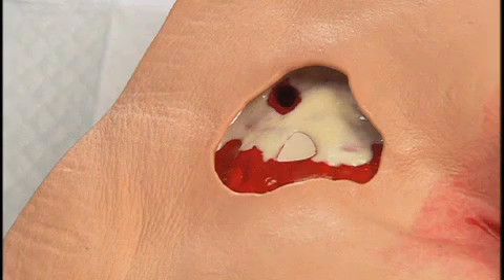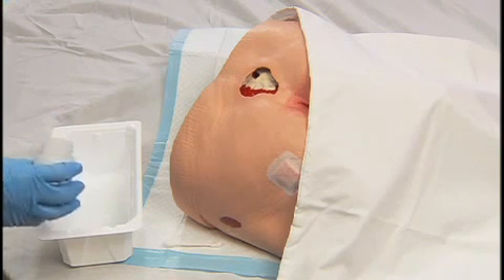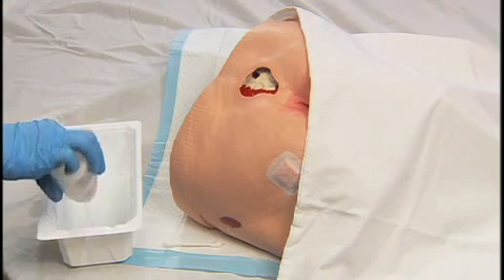Wound Packing. Dead space in a wound promotes increased bacterial growth. Packing promotes healing from the bottom up and avoids abscess formation at the wound depth.